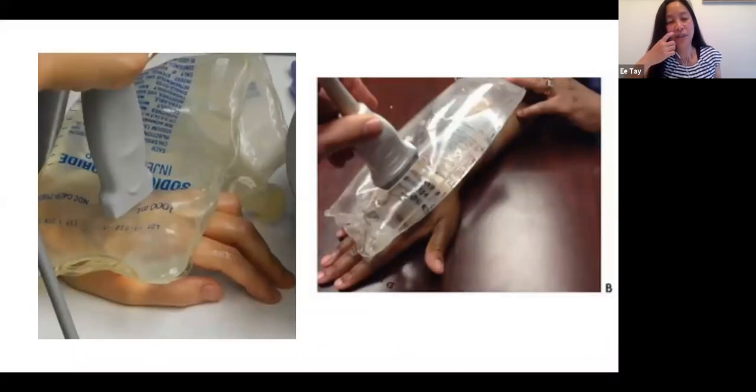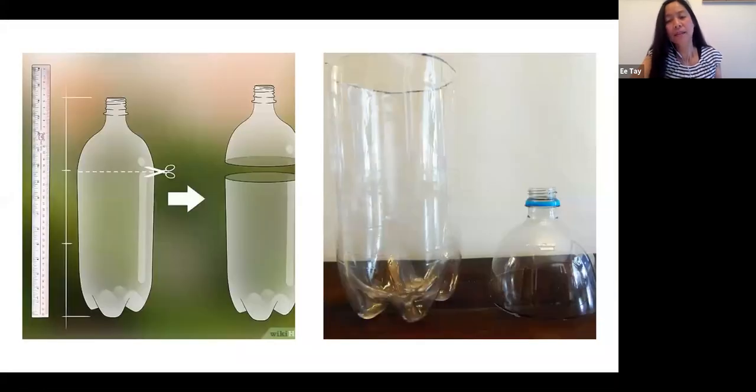I've also tried it with an IV bag. I can't say that this works nearly as well. You have to get some fluid out in order to optimize that image, but I'm better off using the gloves. One of the things we've also tried, which we read somewhere, is that if you have access to your entire limb or the entire body part, you can ultrasound almost 360 degrees, but partly using the technology that you would use for a water bath.